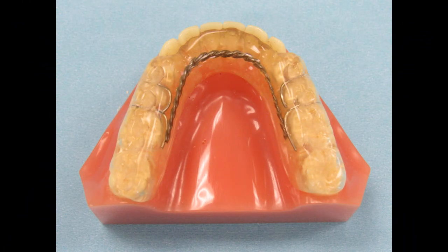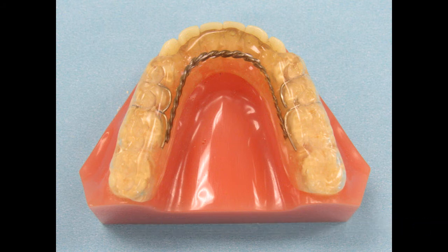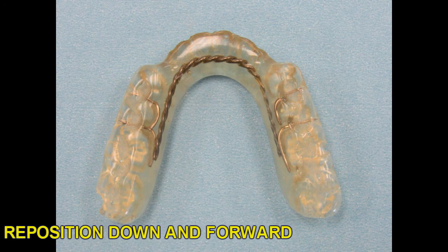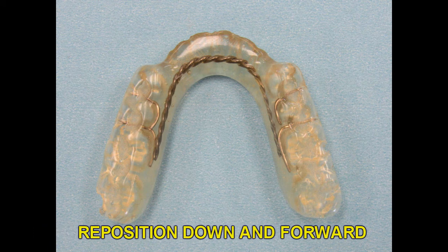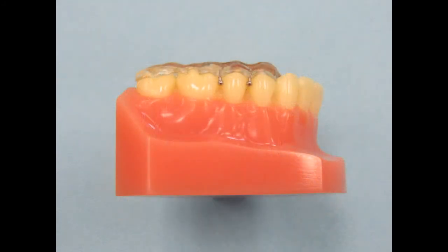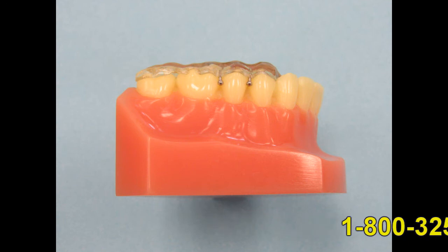This TMJ orthotic was developed by Dr. Jay Gerber. It's a lower appliance fabricated from hard acrylic with multiple ball clasps on each side for good retention and a braided anterior wire to increase the strength. The appliance is worn on the lower arch and has deep indents and a small lingual flange to make sure the patient bites and functions in the desired anterior position and vertical. This neuromuscular orthotic will bring the mandible down and forward to decompress the joints and allow the muscles to function properly. The orthotic is worn 24 hours per day, and it's important that the patient eats with it in place. Dr. Gerber recommends taking the construction bite with the assistance of a TENS unit or K7. The Gerber orthotic is worn to get the patient out of pain and help find the correct position of the mandible to keep them out of pain long term.